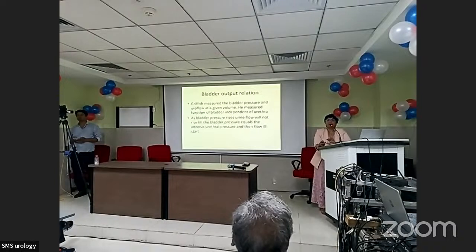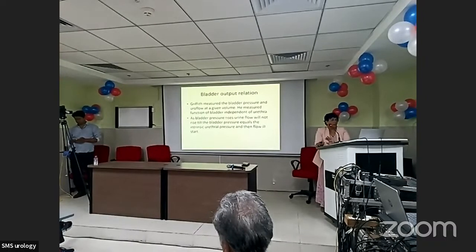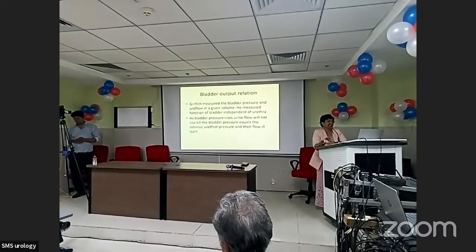But in practice, they actually don't matter to a great extent, and we do not depend on them to take a decision. But it's important to know, and they're automatically generated in any of the recent software. So what Griffiths did was he measured bladder pressure and urine flow rate at a given volume of urine.